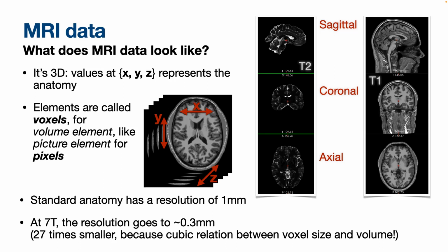Now, if we move to a 7 Tesla scanner or a 9.4 Tesla scanner, what we have is a stronger magnet that allows us to resolve a higher level of spatial detail. And so in the same period of time, we can acquire a brain with a higher level of detail. There are all sorts of pitfalls, but what we can do is decrease the voxel size and make the measurement more precise. I'll show you a bunch of examples where we have scanned half of my brain at 0.3 millimeters. That's 300 microns. That's already at the limit of what you can get with a non-dead person. I'm very trained at lying still, so you can acquire like 45 minutes of data for one image, right?